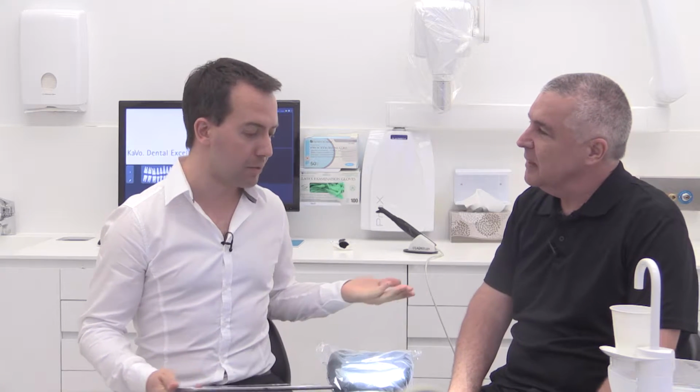No, look, I agree in my experience. We've had a question about item numbers. Is there an item number that can be claimed regarding a DIAGNOcam image? Yes, it would be the intraoral photography, which would be the 071 code that we currently have in the ADA schedule. That would be the right code to bill for that. All right, absolutely. Good to know.